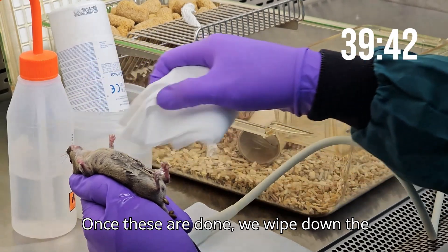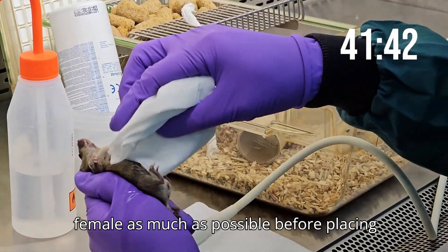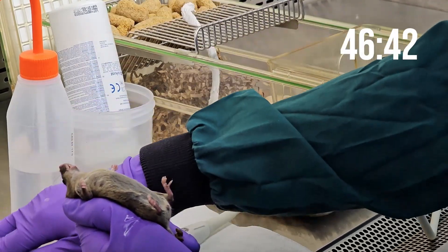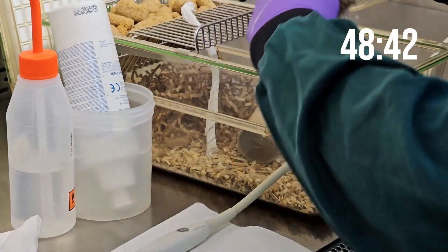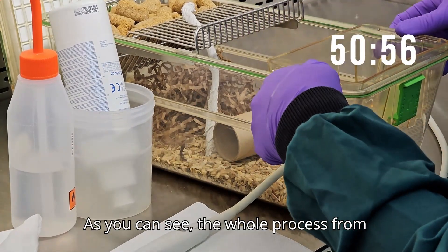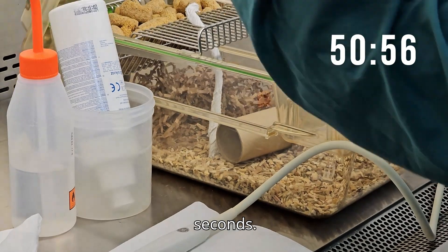Once these are done, we wipe down the female as much as possible before placing her gently back into the cage. As you can see, the whole process from start to finish takes just over 50 seconds.